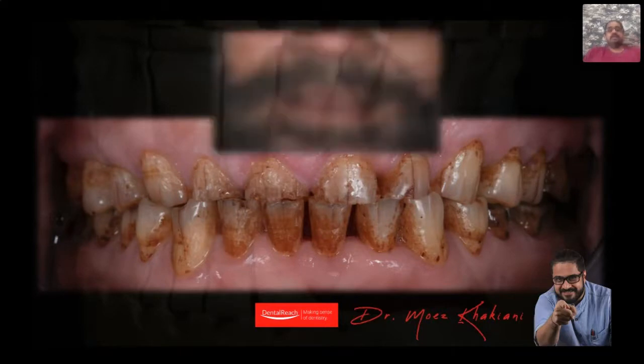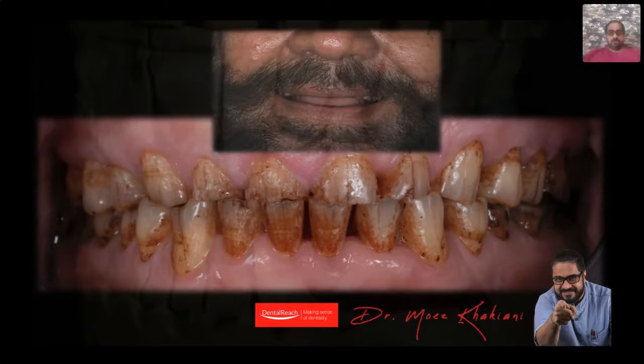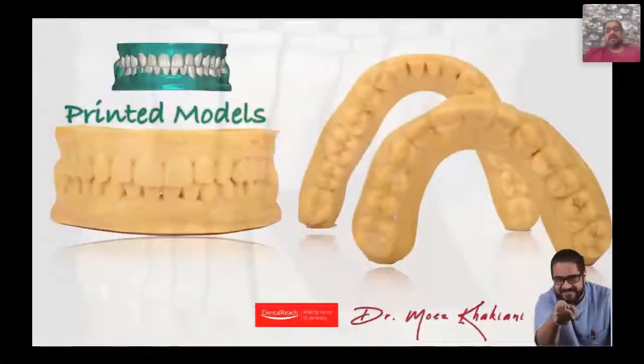This patient again did not smile much. Why? Because he does not show a lot of tooth structure when he smiles. What did we do? We went ahead and did the same protocol. We made impressions, we mounted the casts, but here we did a slightly digitalized version of treatment. After having done the digital mounting, we used a virtual articulator to design the wax up and then printed 3D models.